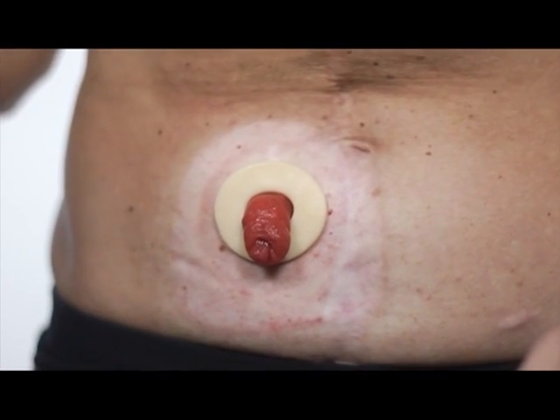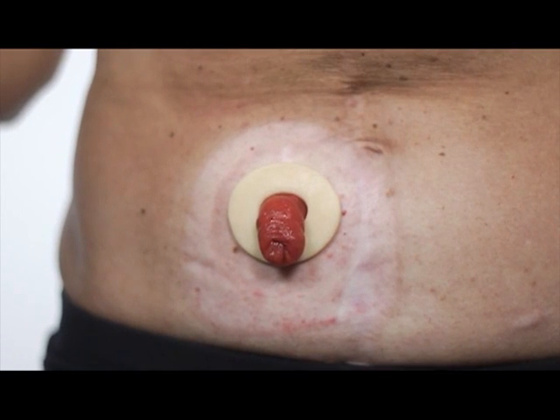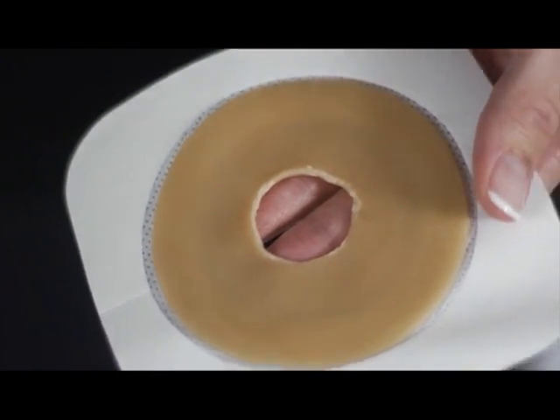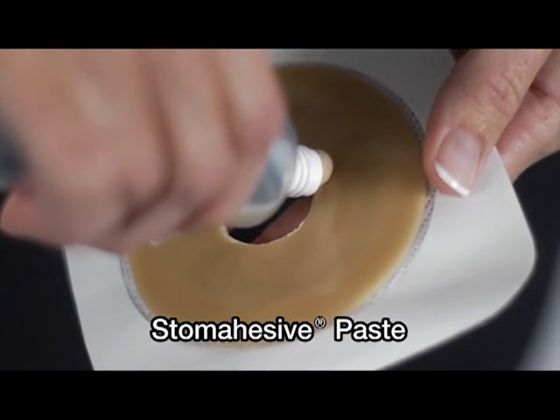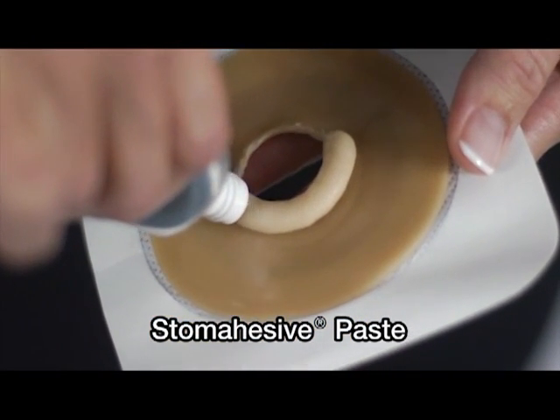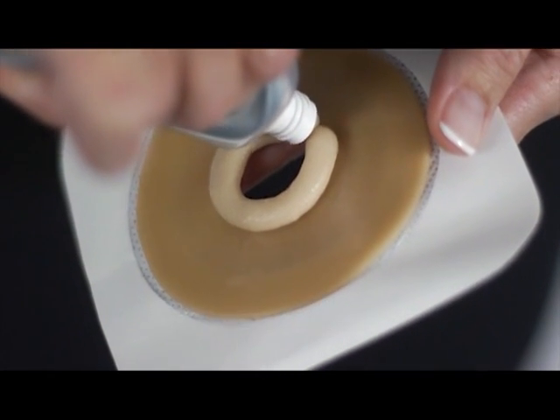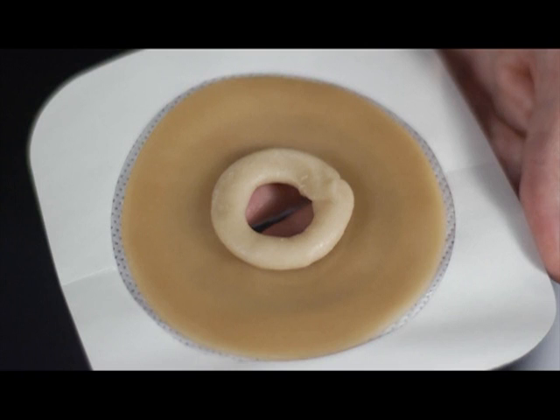You can also break the seal into smaller pieces and roll or mold to fill in gaps or folds. For additional skin protection, you can use a small amount of Stomahesive Paste to fill the gaps between the wafer and your stoma. Apply a thin ring of Stomahesive Paste to the back of the wafer, closest to the opening of the hole. Do not spread the paste. Allow paste to sit for 1 minute. Then continue applying your wafer and pouch.